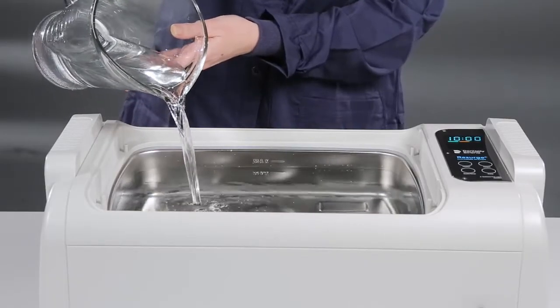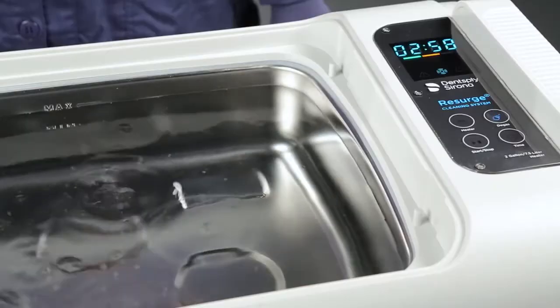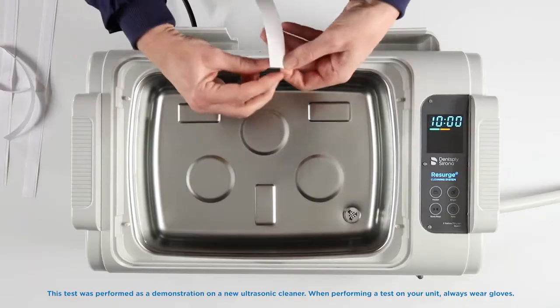To run the test, first fill the cleaner with water to the max fill line. Run the ultrasonic cleaner's degas cycle as directed by the manufacturer's instructions for use.